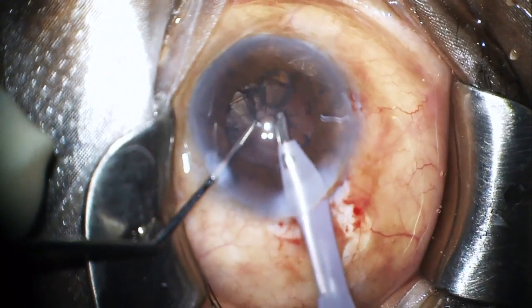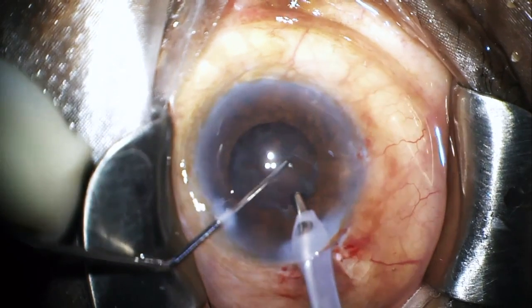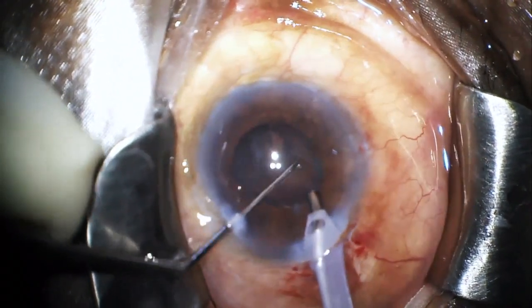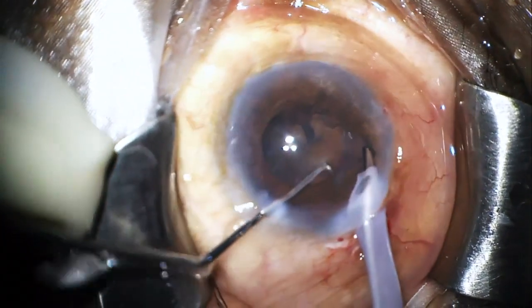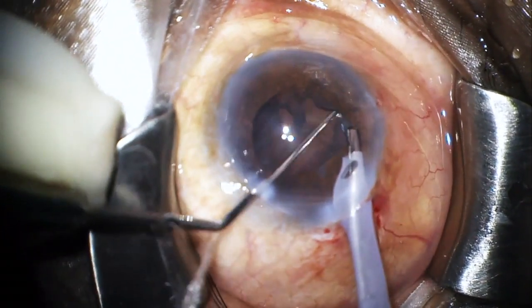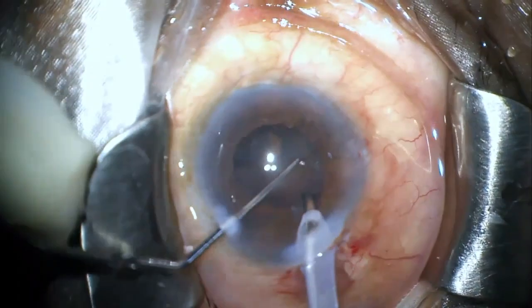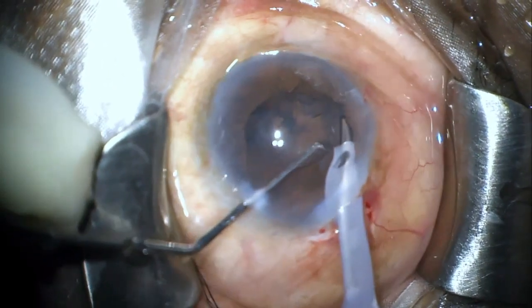I am almost finished with the phacoemulsification and before I withdraw the probe from the eye, I notice a bulge in the inferior part of the iris which raises the suspicion of a hidden fragment in this area. I tried to retract the iris with my phaco probe and used my chopper to tease the piece and take it out.